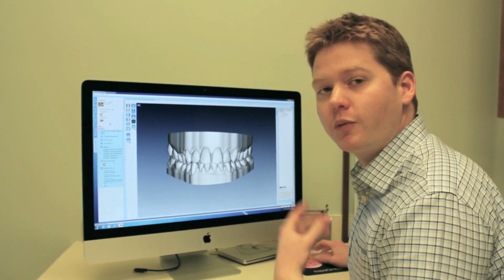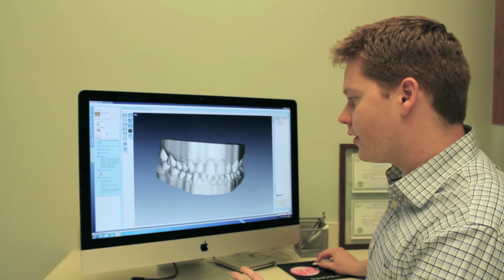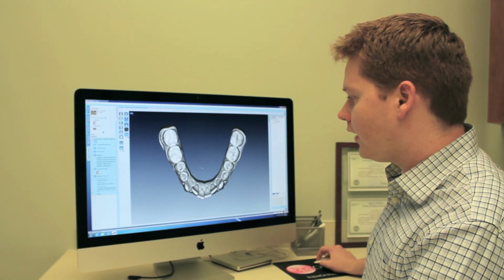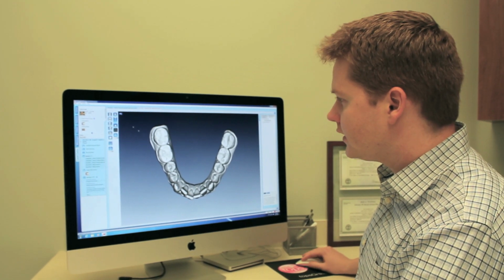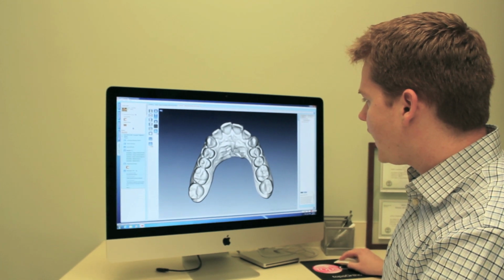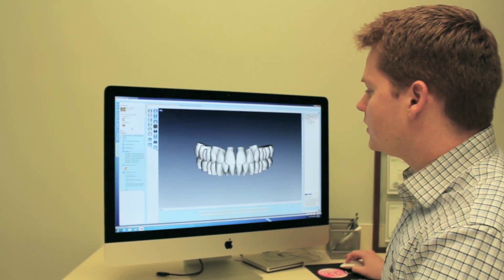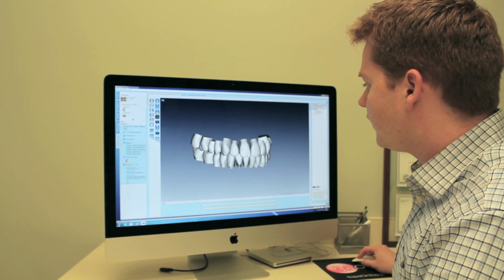Okay, so before we head on into the clinic, I want to show you what this looks like on the computer. So when we send the impressions to Incognito, they actually input that data into the computer, and so you see an actual one-to-one representation of the teeth. And so I can look at what the teeth look like in her mouth today, and so we can see crowding on the lower arch, and then we can look at the upper arch, and we can see a little bit of crowding. Doesn't look too bad. We've got a little bit of overlap right there, some minor rotations, and so things that we would like to fix. And so what they actually do is they set up the teeth now in an ideal way, and so then we have the teeth where they look perfectly straight.